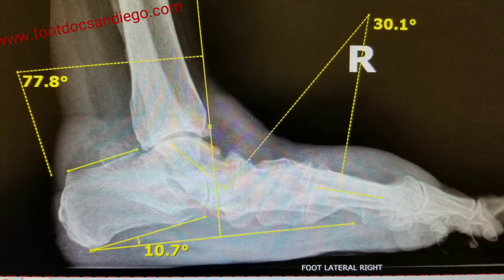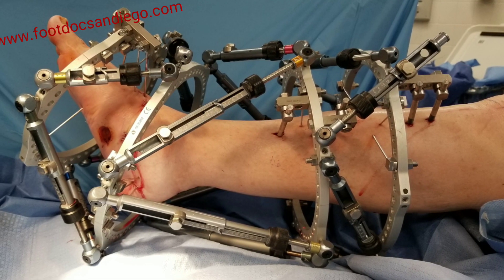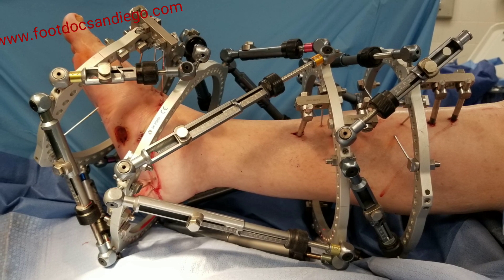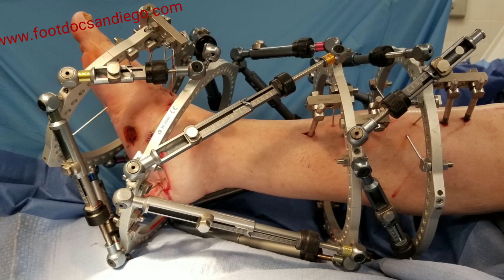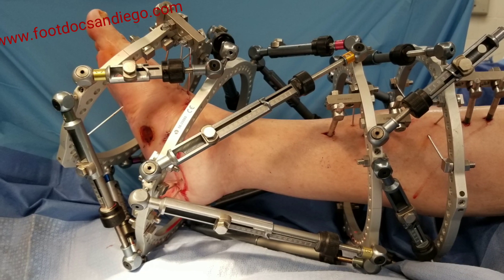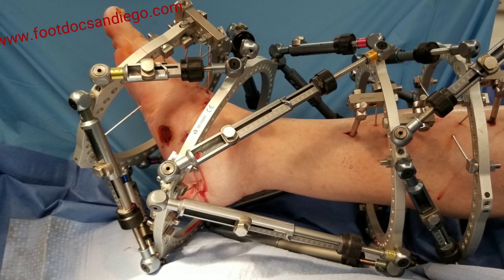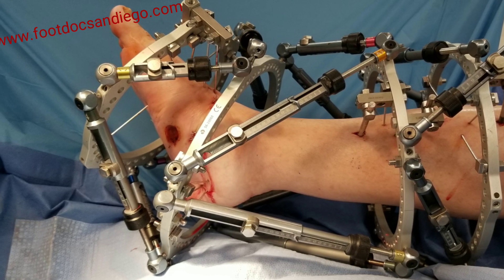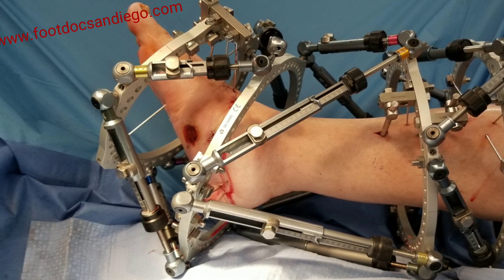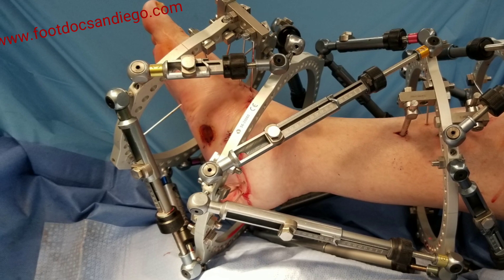The decision was made to do a gradual deformity correction with a hexapod external fixator, then to convert to internal fixation. A miter frame was built for multiple deformity correction at the same time in a gradual fashion. The posterior aspect of the frame was performing the gradual equinus correction and the gradual correction to remove the patient out of severe valgus — the patient had 45 degrees of valgus. We did not want to hurt the lateral structures. There is no issue with applying the external fixator with a wound present, and the osteotomy can be made even close to the wound without any issues.